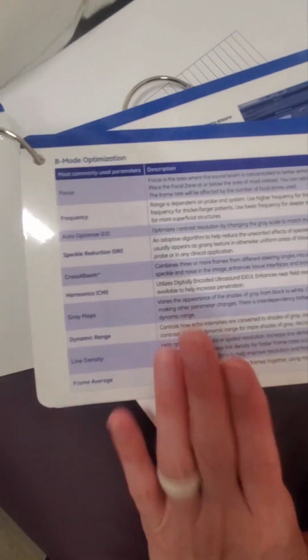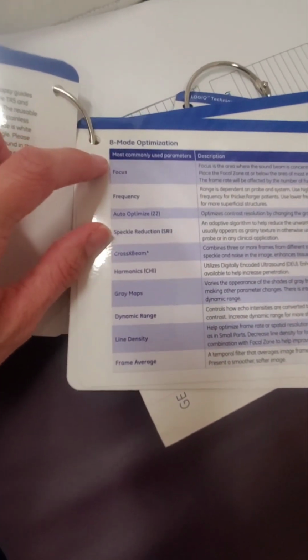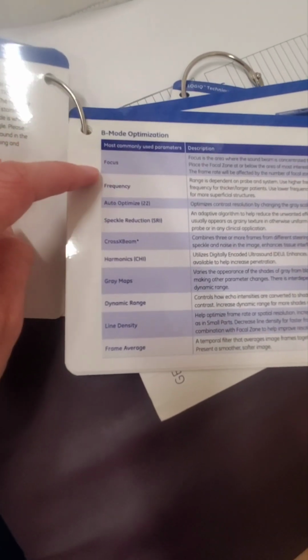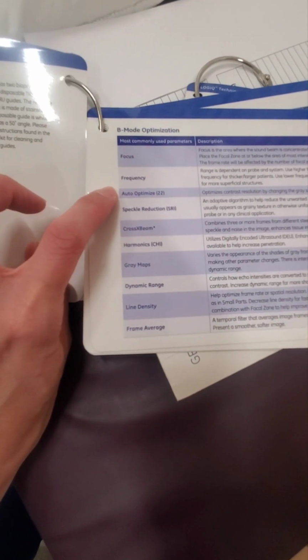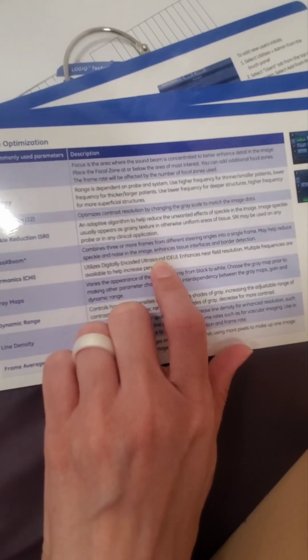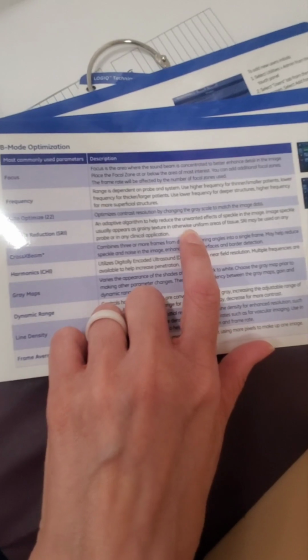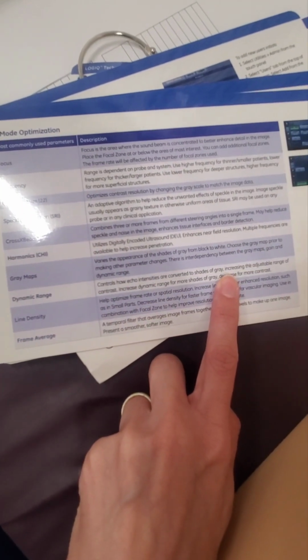Optimization, this is your physics. Telling you how to make your image optimized, how to make it better, right? How you use your focus, your frequency. You're not allowed to auto-optimize while you're in school. Speckle reduction, and then it tells you what it does, okay? This information is going to correlate with the information in your physics. All this stuff that you can do, you're going to learn about in your physics class.